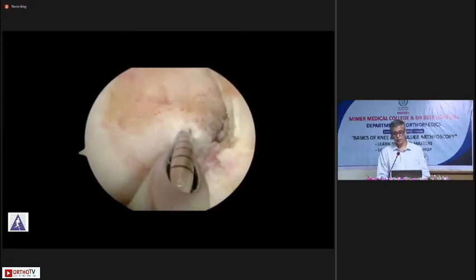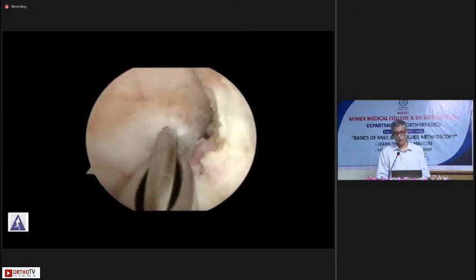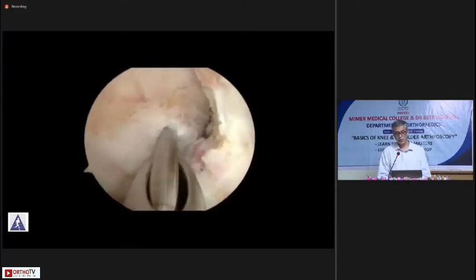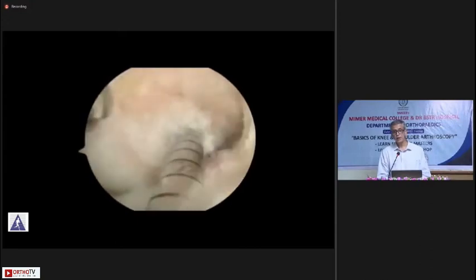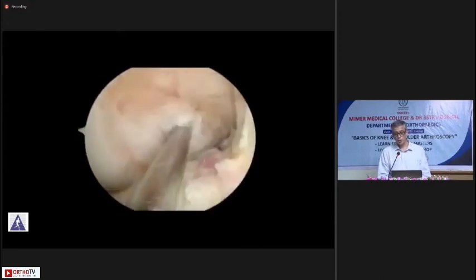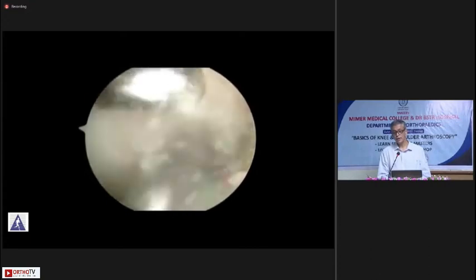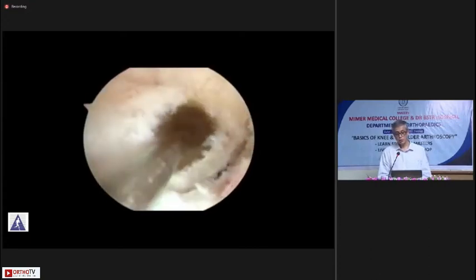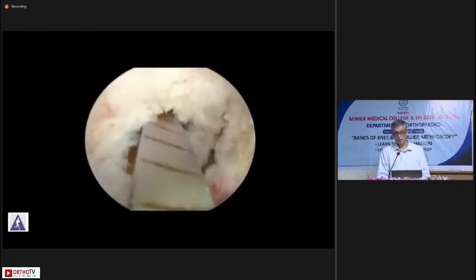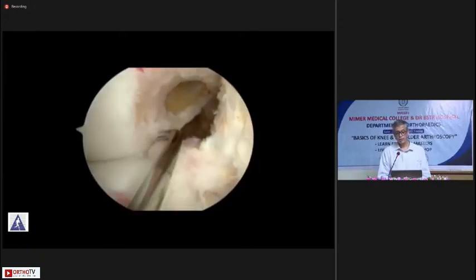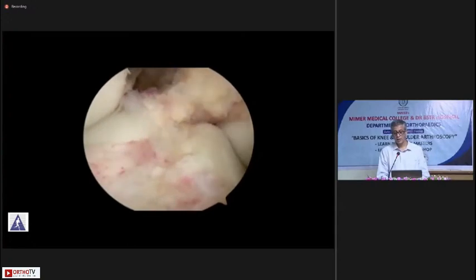Femoral tunnel malposition is the leading cause of ACL reconstruction failure, so don't be afraid to spend time making your femoral tunnel. Always try to view the femoral footprint from the anteromedial portal while making it — this makes a significant difference. With your guide pin you can manipulate to get the desired femoral tunnel length. Drill with the knee in hyperflexion for an extremely good view. Use a small tissue protector if needed, then over-drill for hamstrings and do definitive drilling matching the graft diameter.